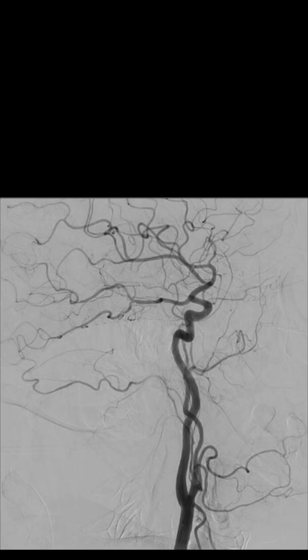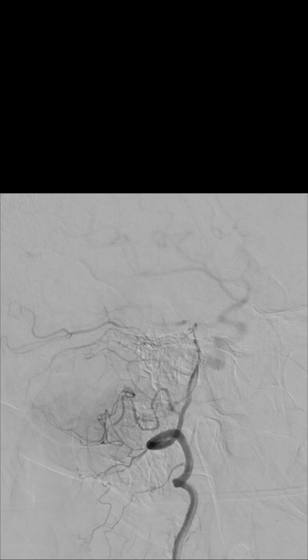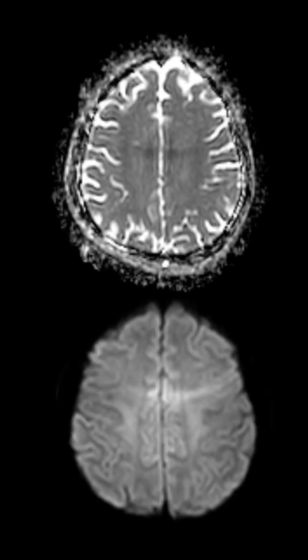Right common carotid artery bifurcation is normal. There is no stenosis. It's a very clean lesion. This is the vertebral artery road map. So when you pull the catheter back, take a shot from the subclavian artery, you can get a road map, and take a shot now just to see how the posterior circulation is. Because we have taken the injection from the subclavian artery, the quality of the angiogram may not be very good, but we are not too much bothered about the posterior circulation.